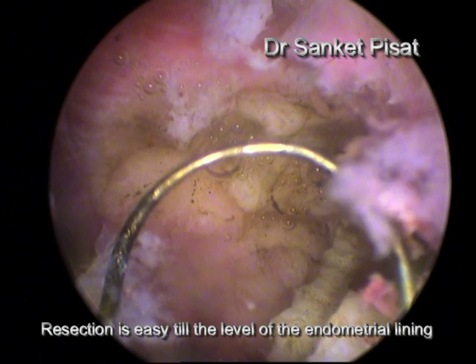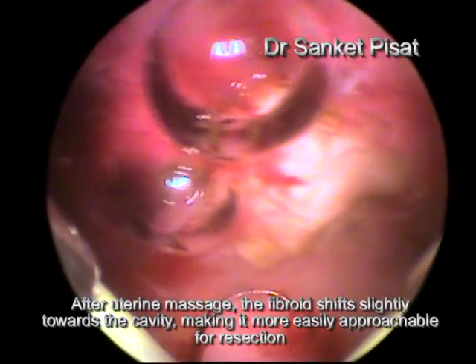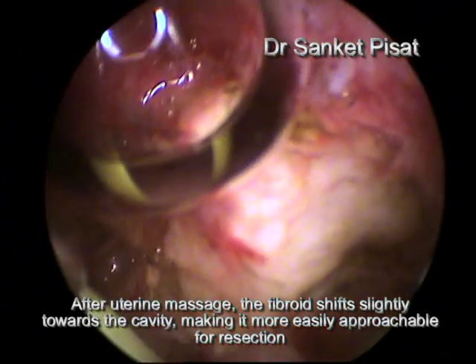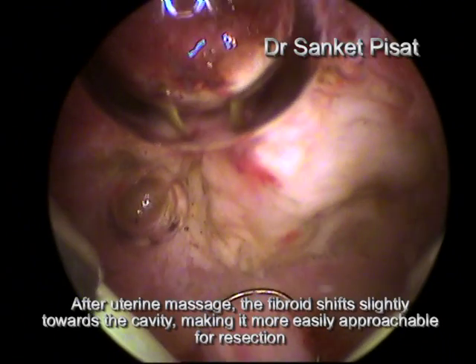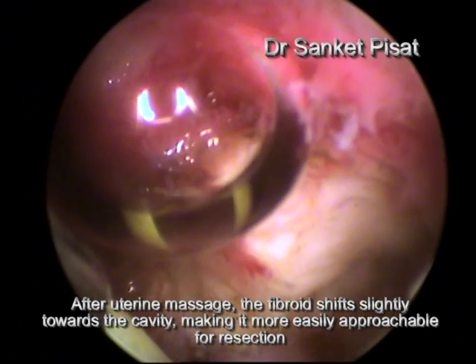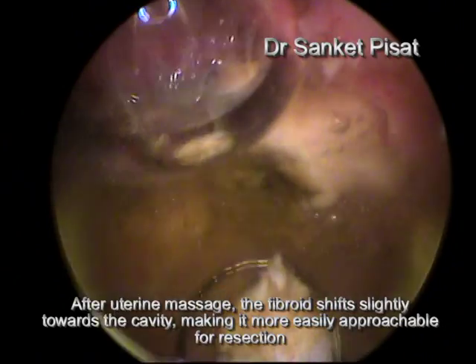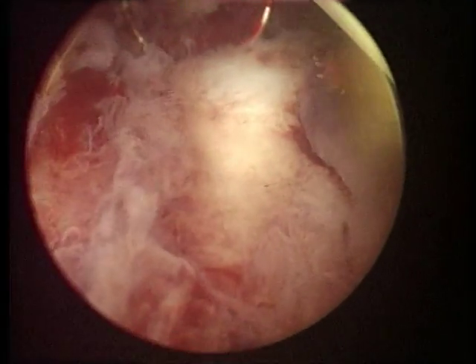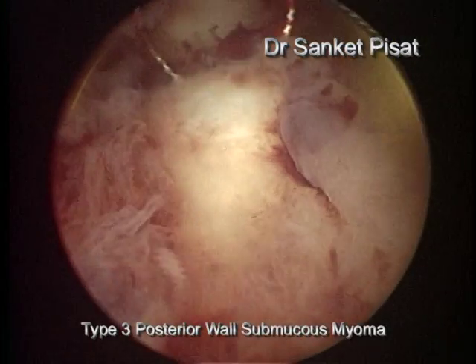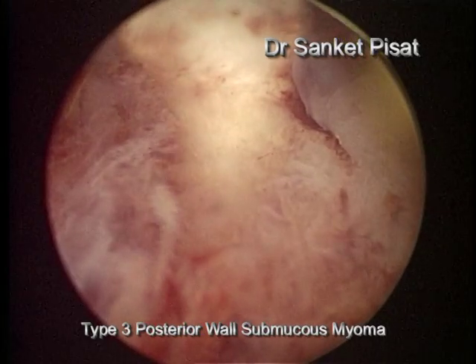At this stage, the hysteroscope is removed and a vigorous bimanual massage is given, causing the myometrium to contract and push the fibroid into the cavity. After uterine massage, when the hysteroscope is reinserted, the fibroid has shifted slightly towards the cavity, making it more amenable for resection. This process can be repeated 2 or 3 times until the entire mass of the fibroid has been removed. This is a patient with a type 3 posterior wall submucous fibroid.